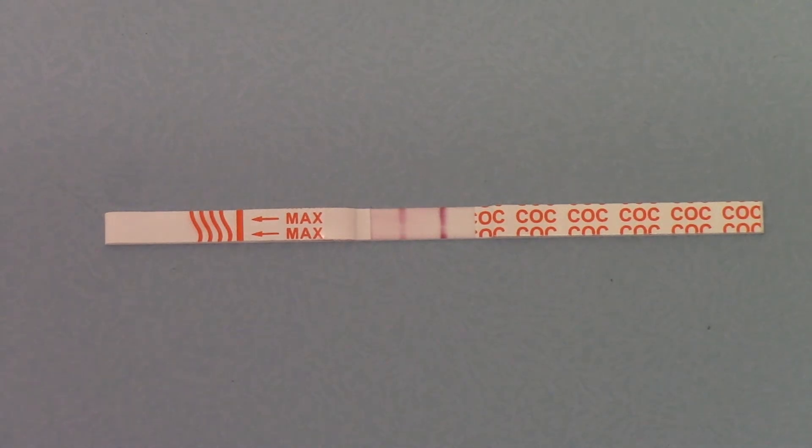This will give users the ability to screen down below what most workplace, healthcare, and other tests are screening at. And if they're getting a clear negative on this test result, they can be confident that on a higher concentration test cut-off, they will definitely screen negative unless they have further cocaine exposure.